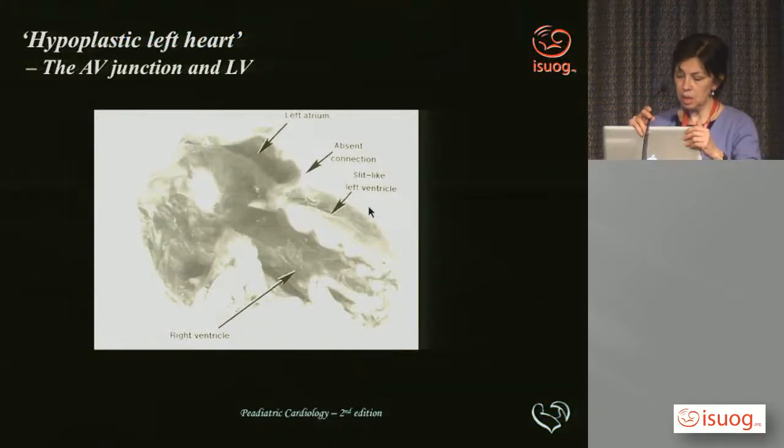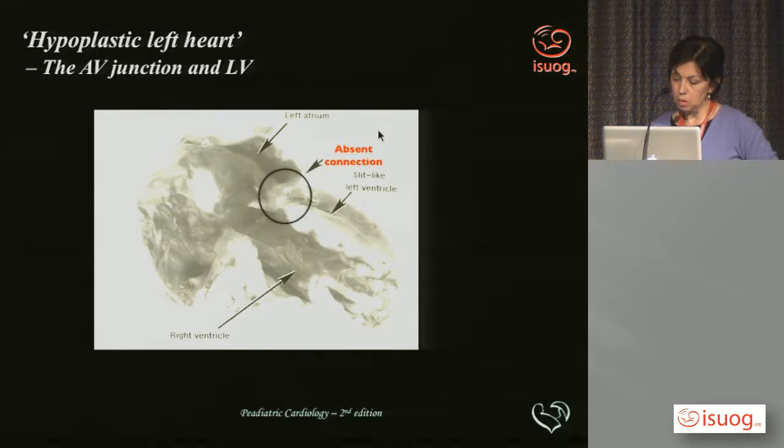This is a scan image. And I'm just going to take you through now a few heart specimens, just to give an idea as to why we have such a great variability. It's not a very good scanned image. It's very, very light, and I couldn't darken it. But it does make the point here to show the region.